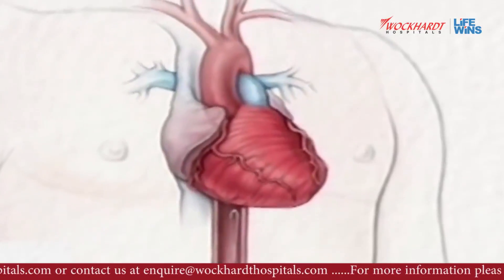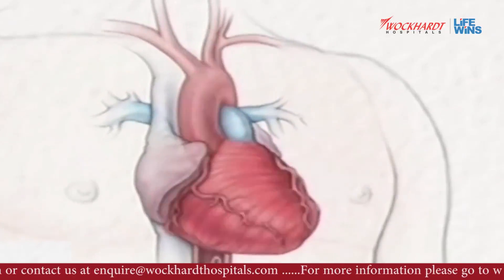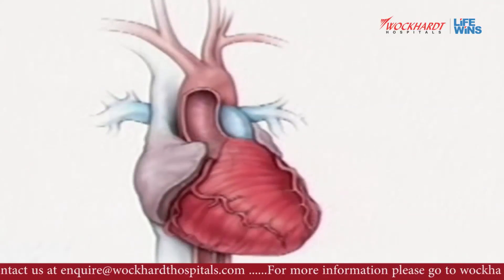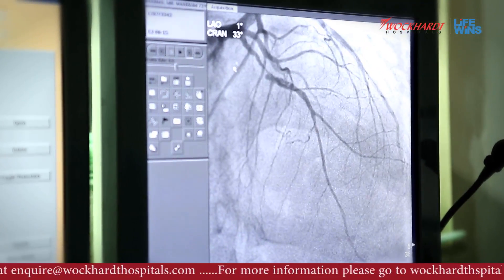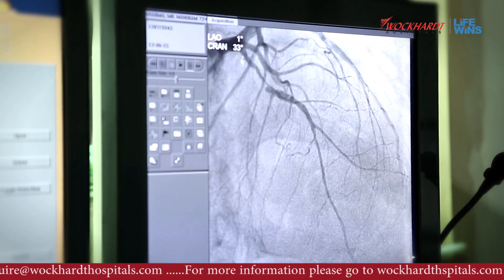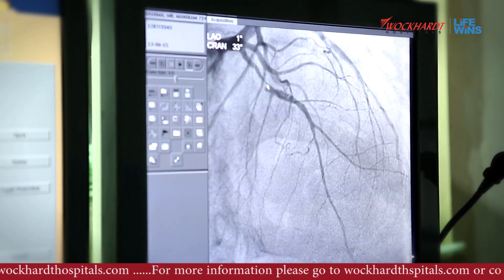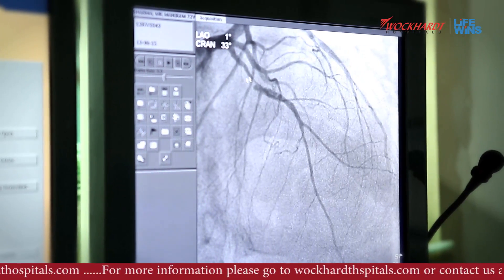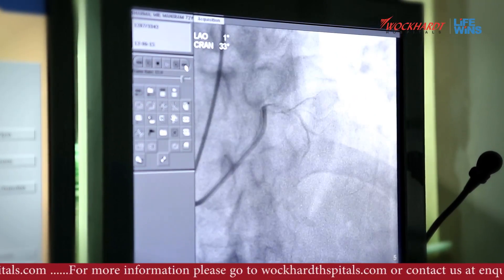There are two arteries on the left. One is the circumflex, which I showed you. The other is the LAD — the left anterior descending artery — as you can see here. This diameter is fine and normal, but here you can see it gets narrowed down, and then again it is fine. It is around 90% blocked.